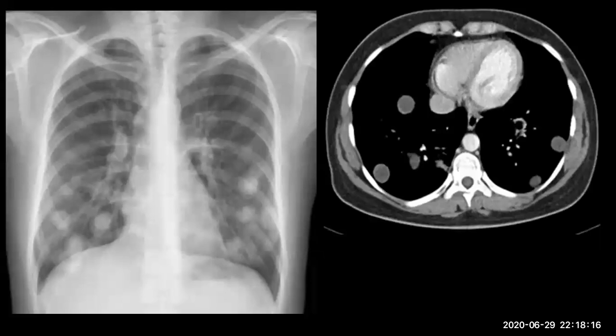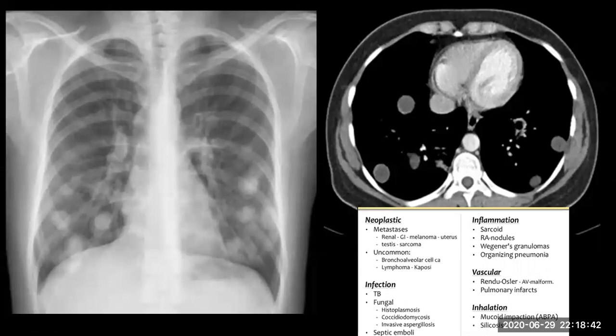It looks like cystic. Unenhancing. Alveolar hemorrhage. Or hemorrhagic metastasis? Cystic metastasis. Okay, these are some of the causes.